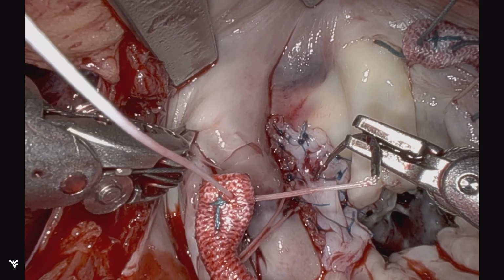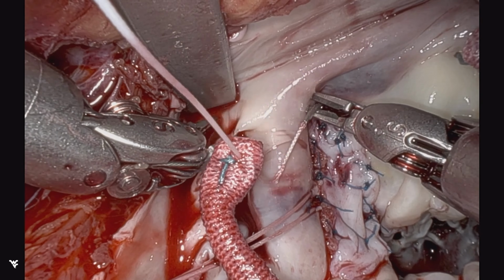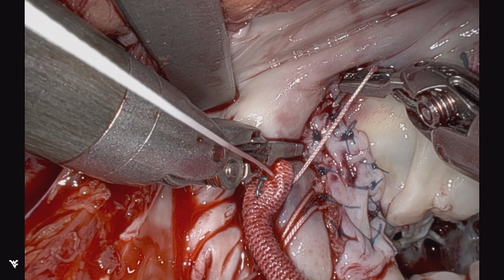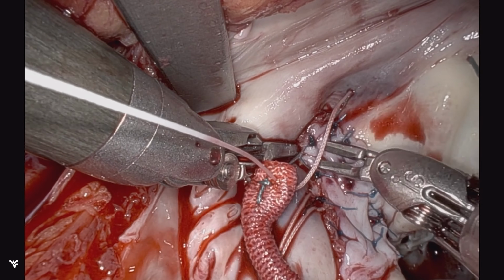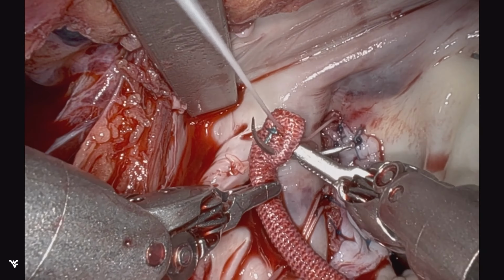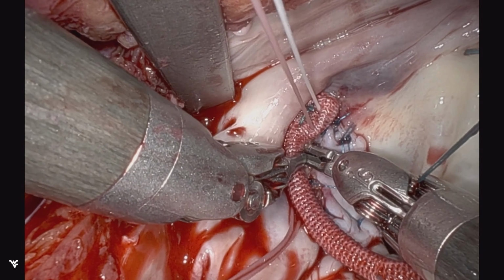Here we see the completed repair and now starting the annuloplasty. This gets to the fibrotic material. You can see using visual feedback, we don't have true tactile feedback, but you can tell that that's very likely the fibrous trigone. And then implanting that at the appropriate location of the annuloplasty band.